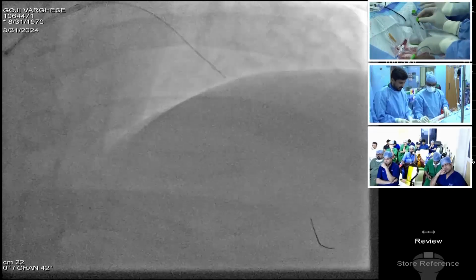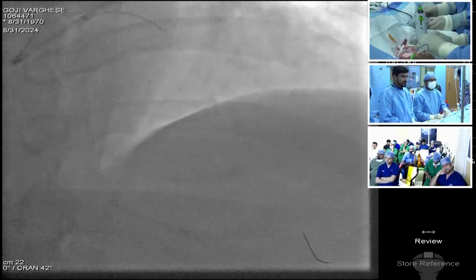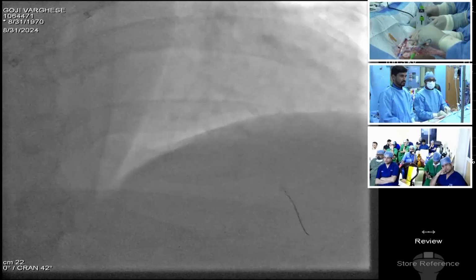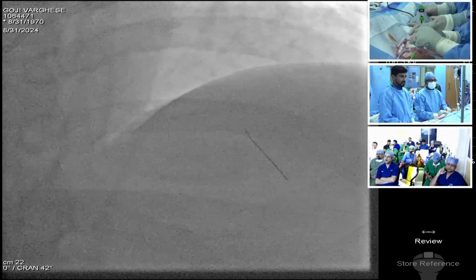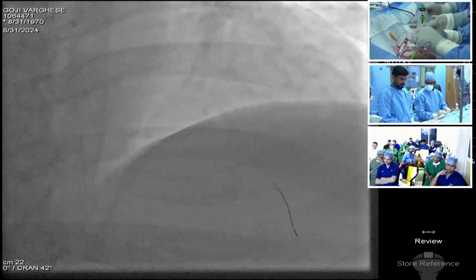You can push the wire. Yeah. Give us the run through wire once again. It's moving, right?